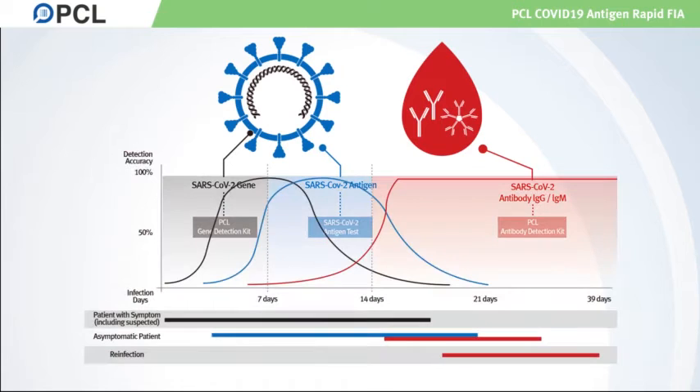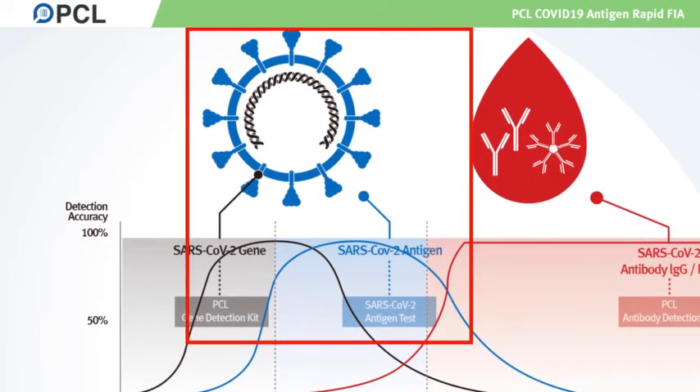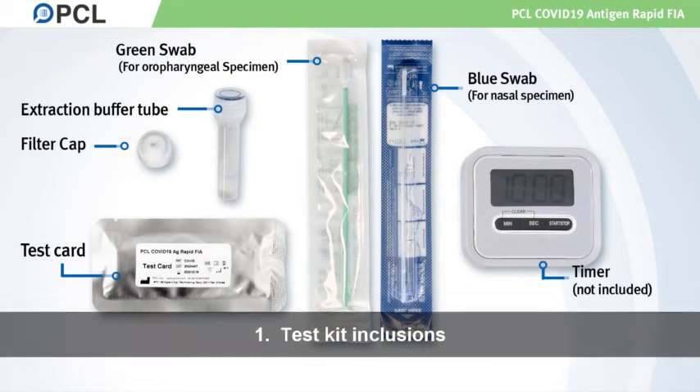Here, we demonstrate how to use the antigen-based testing kit for COVID-19. Before we begin, make sure you have all the components shown in the picture.